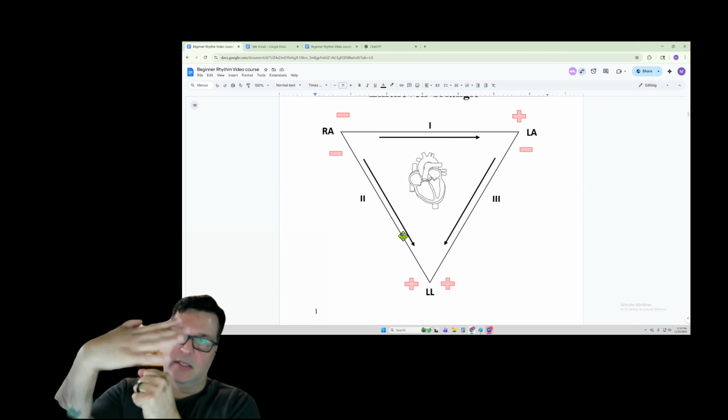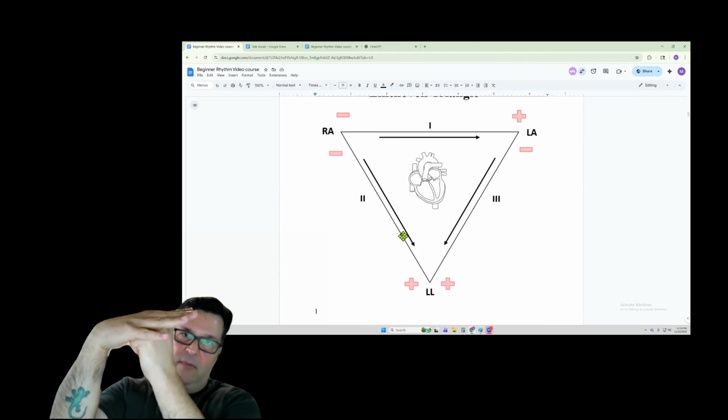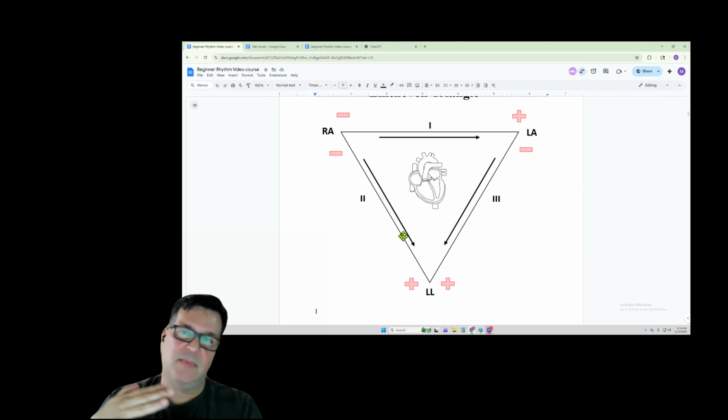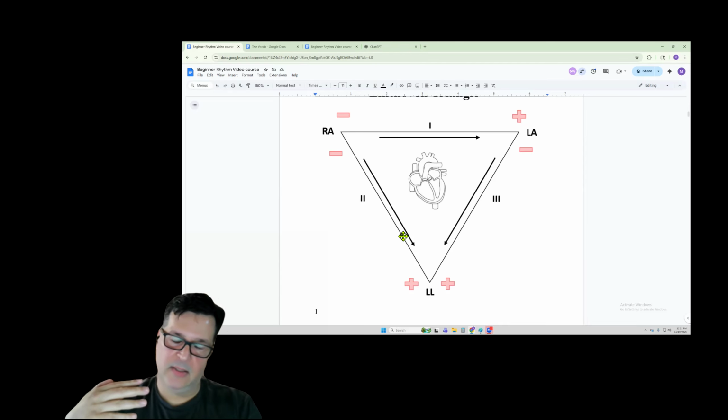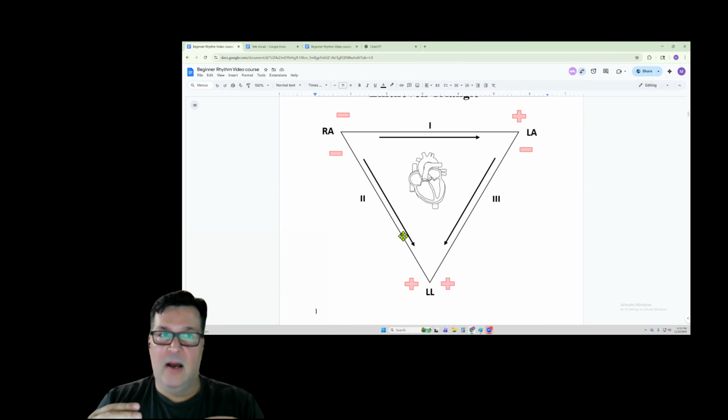If this is the heart and this is the brown lead on the chest, it measures the direction towards or away from the sticker itself, the lead. So that's why it needs to be right there, because if it's not on top of that landmark, it's not sitting on top of the heart. So you'll have a low amplitude or a bad picture of the V lead.